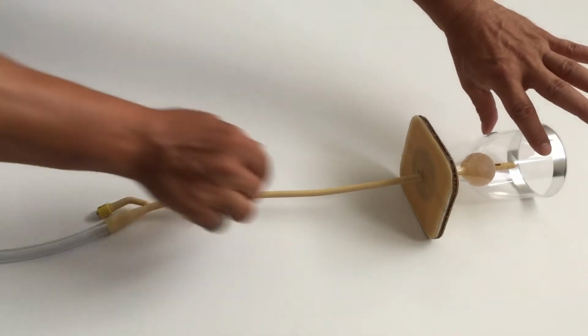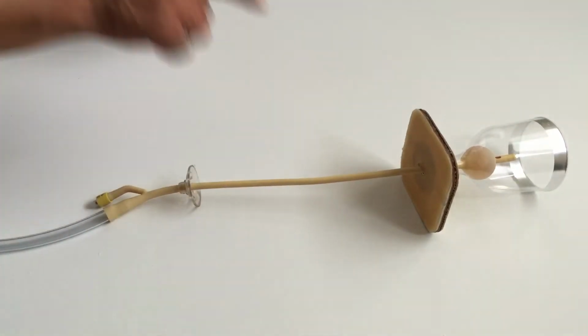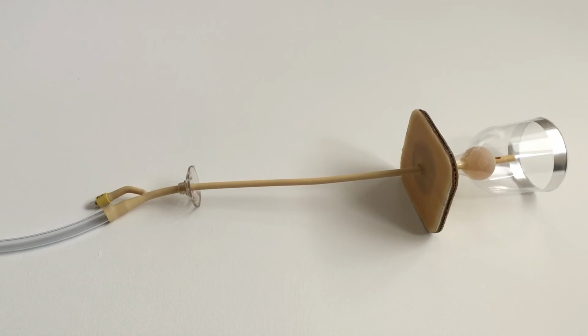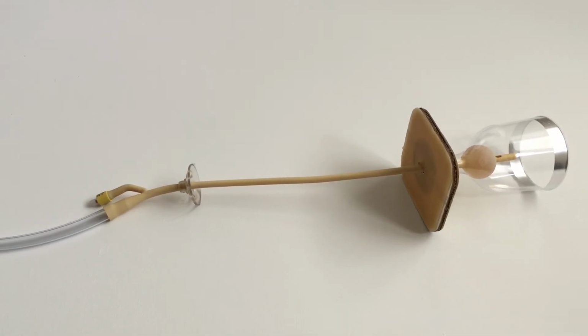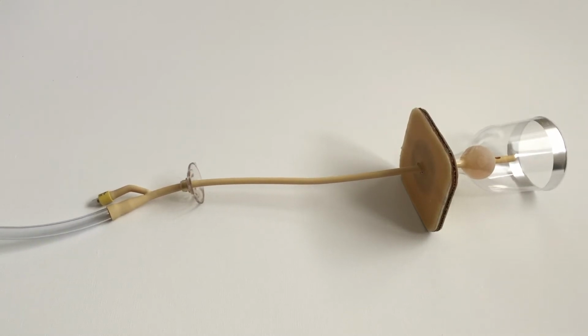And then, as you'll see, as with every insertion, the catheter is intentionally pulled taut to purposefully position the balloon in its ideal and most optimally functioning position, which A, creates a physical barrier to any leakage around the catheter and its balloon to the outside of the body, and B, this closure, in effect, seals the bladder, preventing outside organisms from gaining access to the patient's bladder and the patient proper.